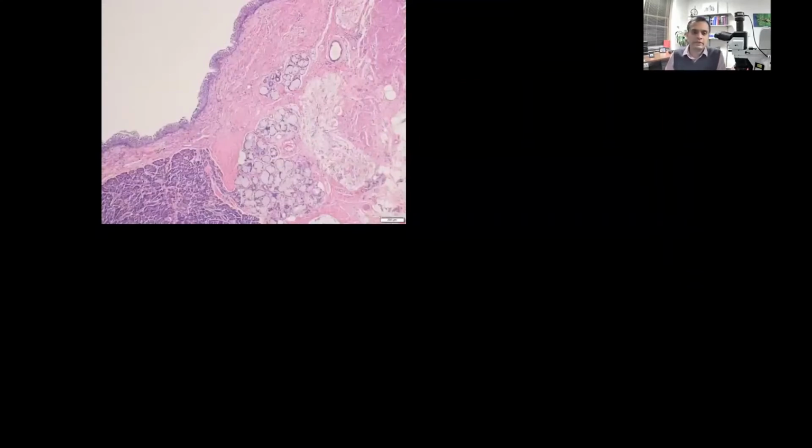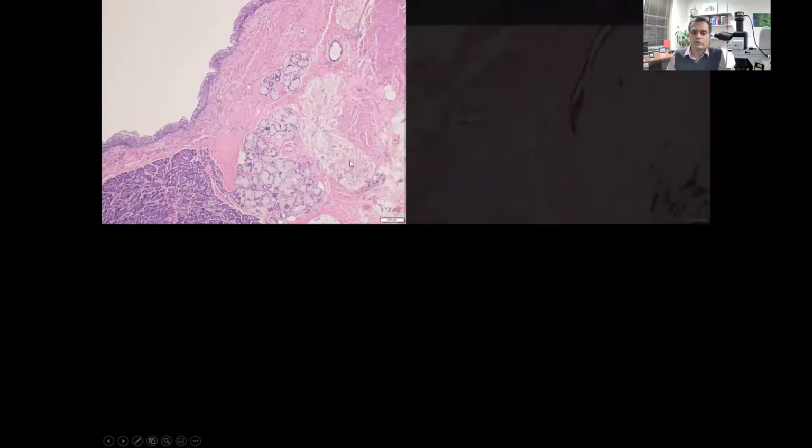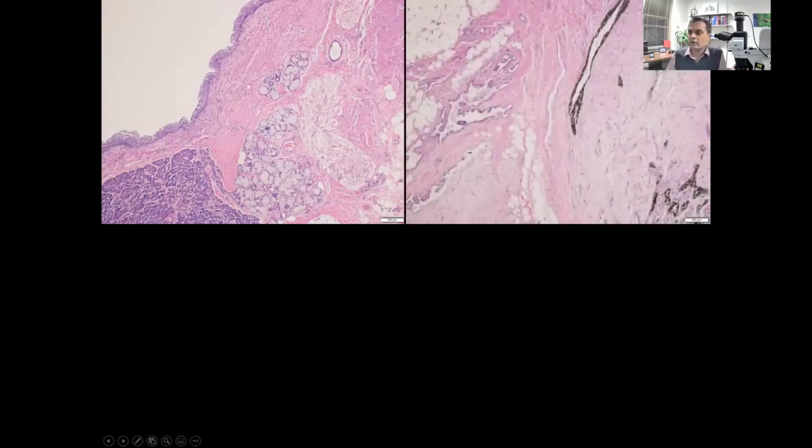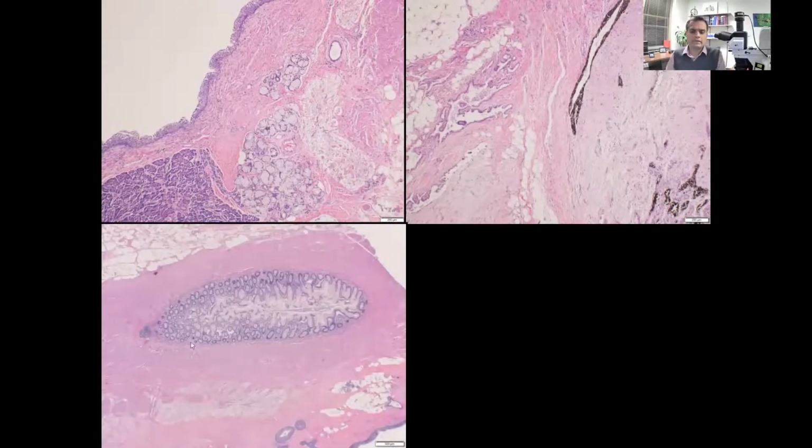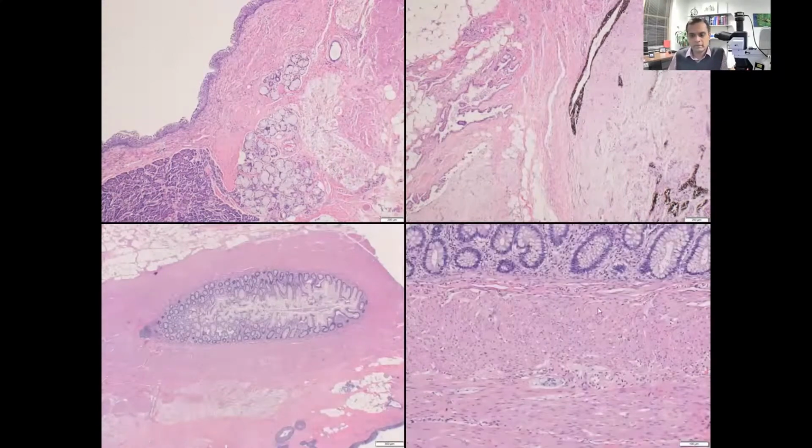Here, as we discussed earlier, we see some really well-formed teratomatous elements, partially squamatized respiratory type epithelium, underlying smooth muscle and underlying mucus glands, some pancreatic acinar-like tissue, again very organoid, and perhaps some neural tissue over here. And then again, you have some neuroectodermal type tissue with the pigmentation and maybe some choroid plexus-like tissue. And then almost an appendix-like element over here with colonic type epithelium and a nice double-layered smooth muscle wall, even with ganglion cells. So this is a perfect organoid formation.